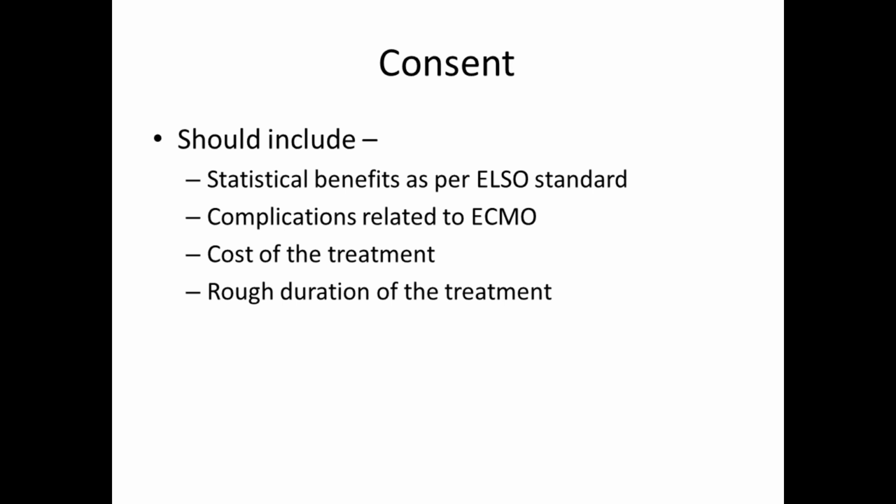They think ECMO is going to be for 3, 4, 5 days. So you have to make it very clear, especially that respiratory ECMO is going to take time. In that, again, H1N1 is going to take more time. Statistically, we found that on average the length of a respiratory ECMO is around 8 to 10 days, and if it's H1N1, it takes still longer, around 2 weeks or 2 to 3 weeks. So you have to tell them that very clearly.